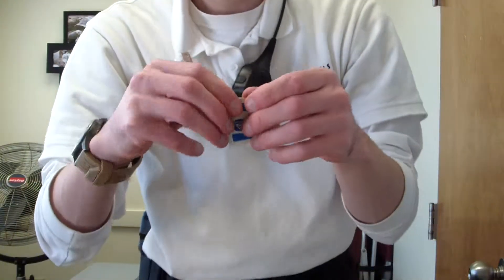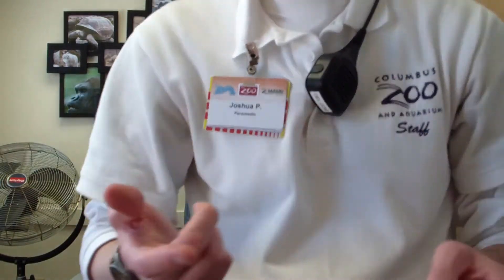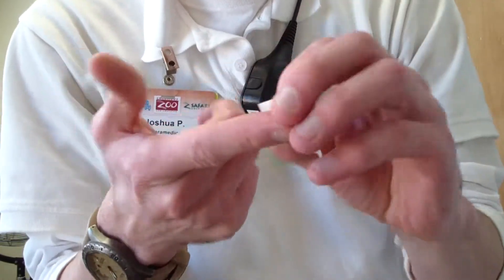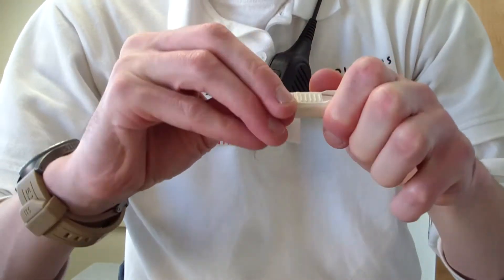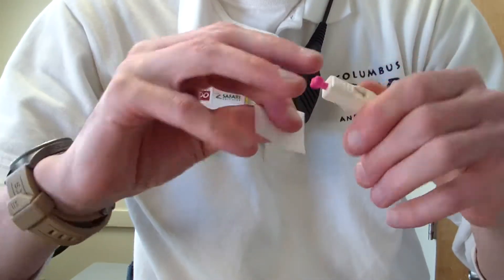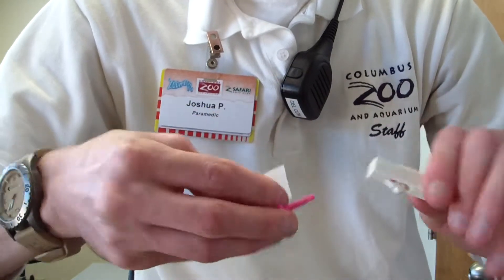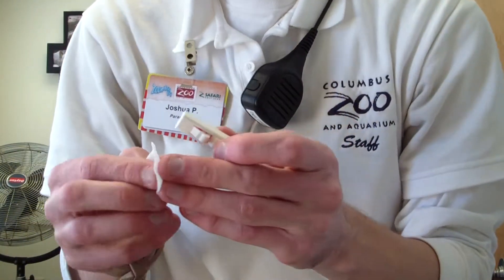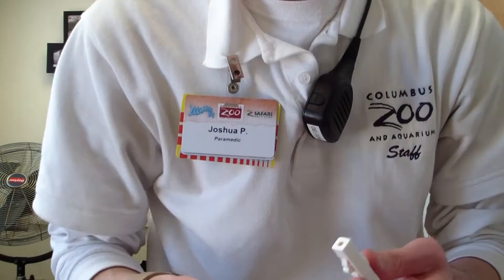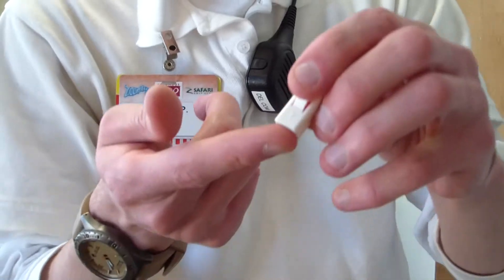So what we're going to want to do is tear our alcohol prep. I'm going to clean my finger here, and I'm going to prep my lancet. Now all I have to do is depress the button on my finger and blood will magically appear. So here we go — three, two, one.